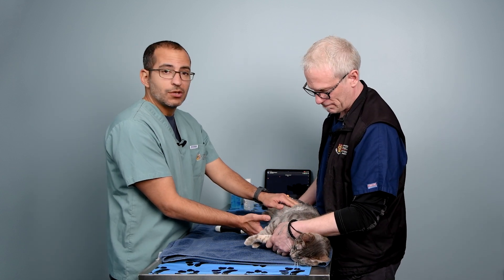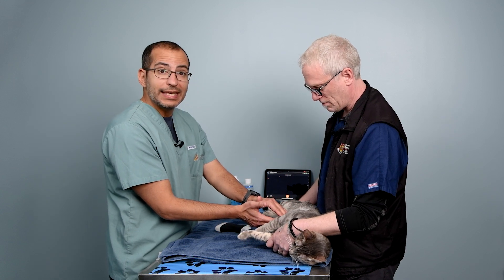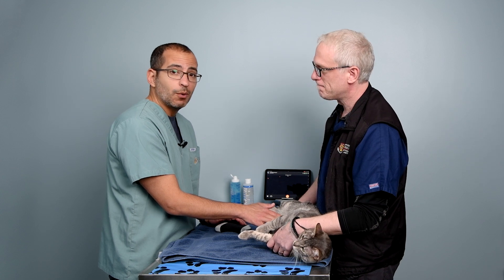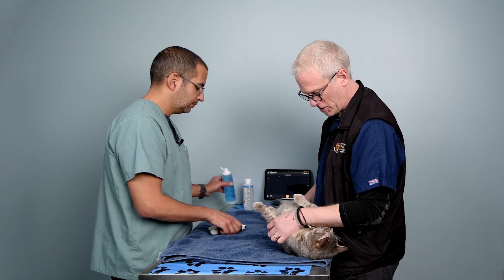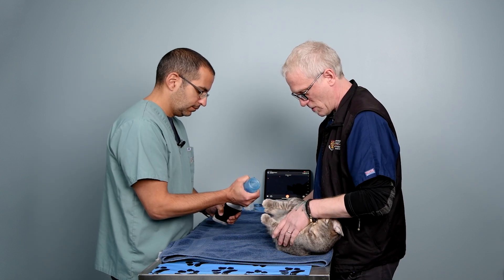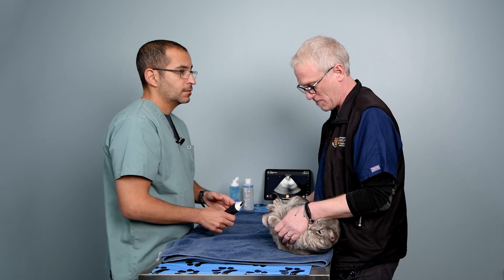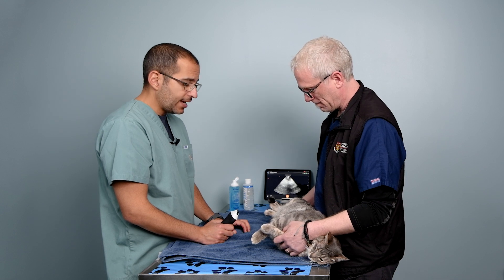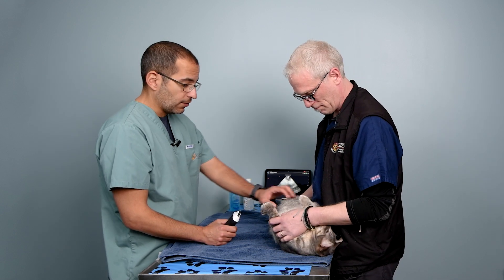A couple things you can do. You can find the 13th ribs on either side and trace them to the palpable V in the middle — that's going to be the sub-xiphoid. Very important to do that and put the probe in there, or else you risk not seeing the liver at all. Correct, and you don't want to be too far caudal because that'll put you over the stomach. We want to make sure that we tuck that probe as far cranial at that sub-xiphoid as possible. We usually use just alcohol; for demonstration purposes today we will also use a little bit of gel so that we don't soak our patient.